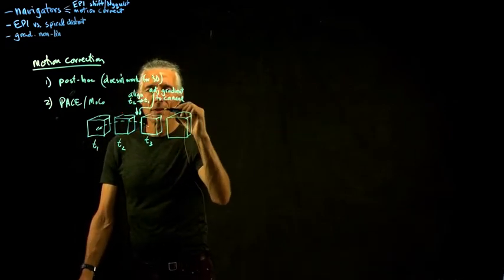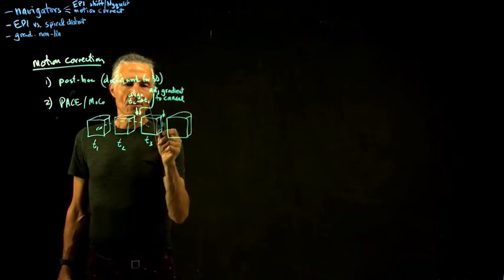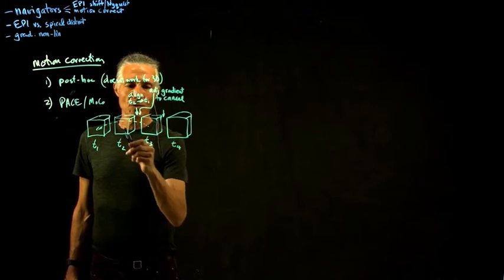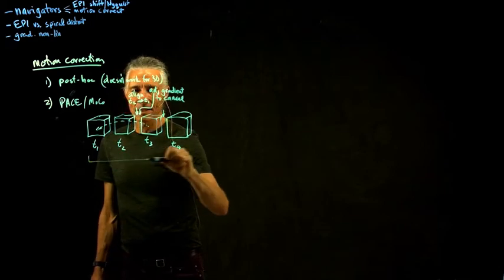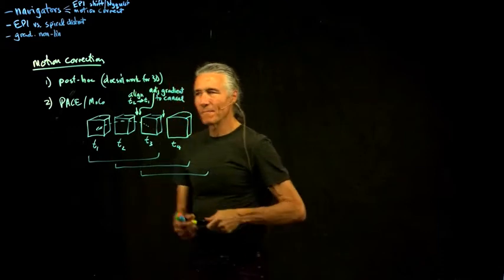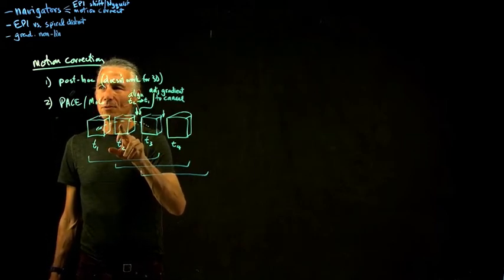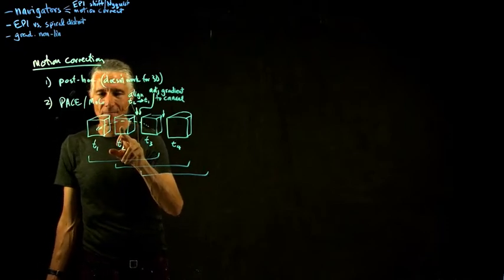But then you could just continue doing this. So at this point, do the same thing. Align. So here we aligned 2 to 1, used it to correct 3. Now here we align 3 to 2, use it to correct 4. So basically you just repeat like this. And then when you're completely done, you run an alignment on the whole thing to correct the ones that were used to derive the correction, but obviously couldn't be corrected because you hadn't collected the data yet.